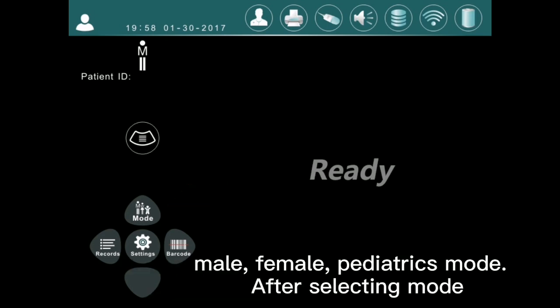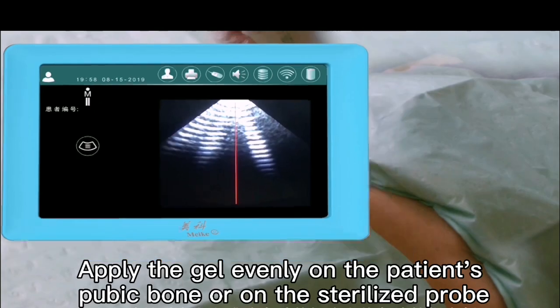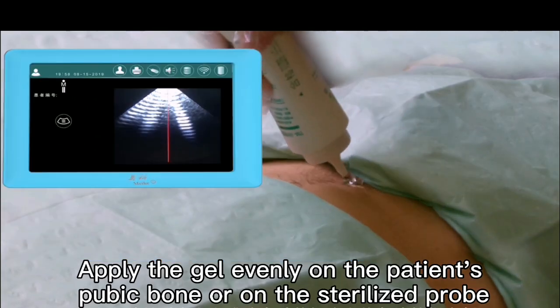Touch the mode button or press the up button to select the scan mode: male, female, or pediatrics. After selecting the mode, press the skin button to enter the pre-scan interface.